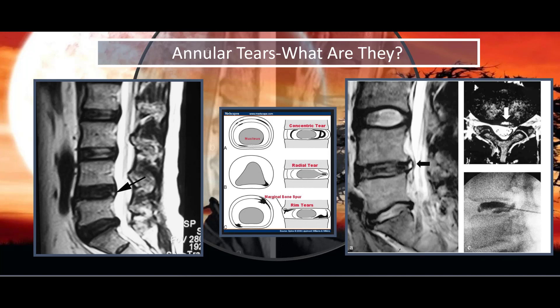Let's look at some annular tears on MRIs. Here where you see my pointer is a side view of the low back, and what you'll notice is a normal disc. You have the bone above, or the vertebral body, similar below, and in between the two you have the disc. That nice bright area indicates hydration of the disc to distribute the pressure.